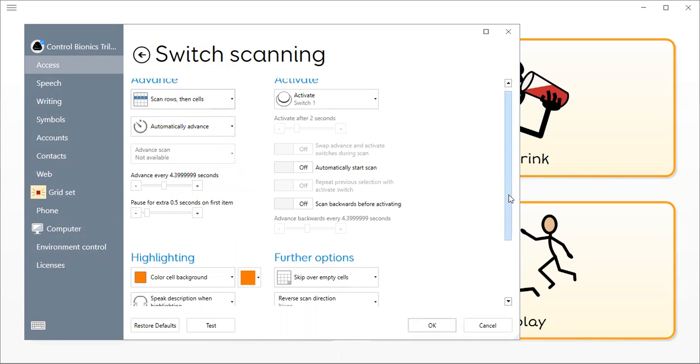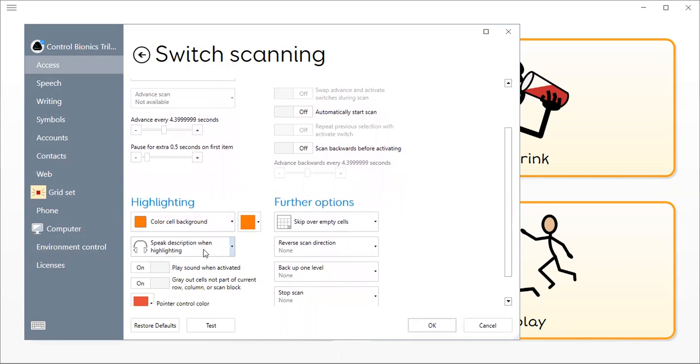I can choose the color that it's going to highlight as it's scanning, whether it's just the border or the whole cell.